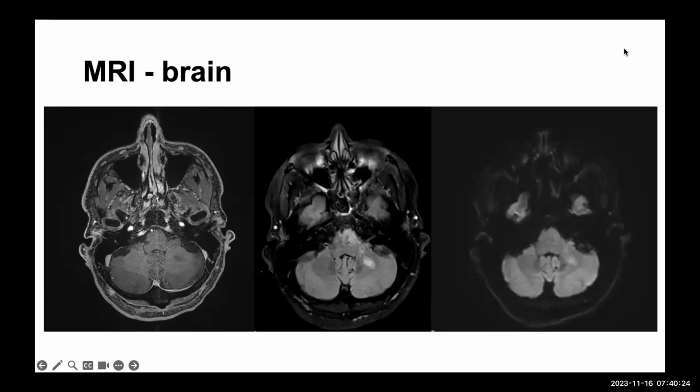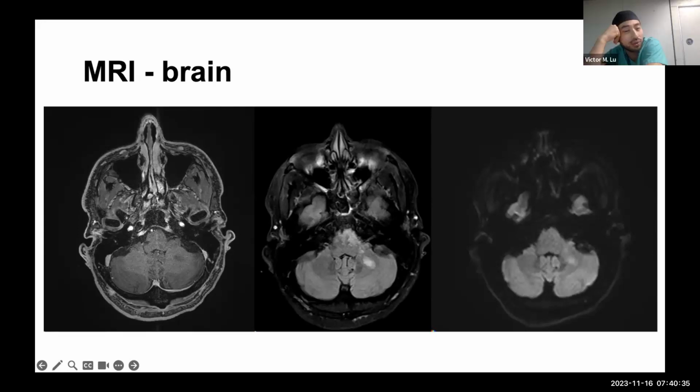So on the post on the left, sorry, on my phone screen, not much is jumping out to me. Sorry, on the post on the left, and then on the ADC we have FLAIR, FLAIR, and then oh yeah, sorry, I have a laptop in front of me, making it a little easier.